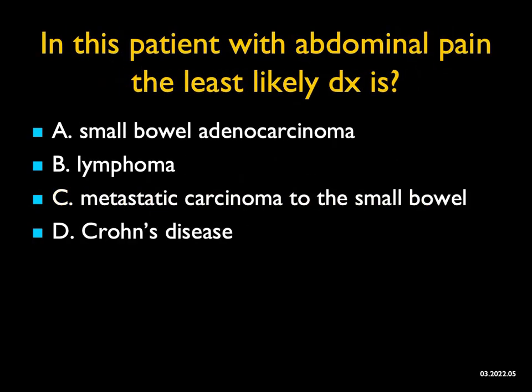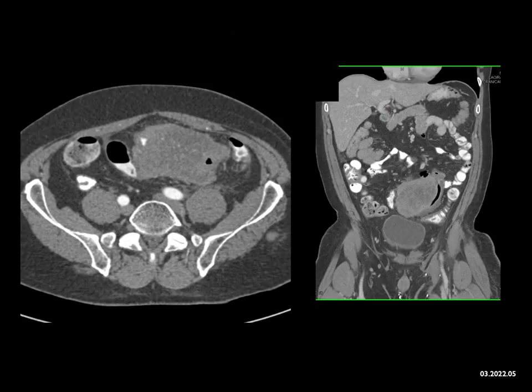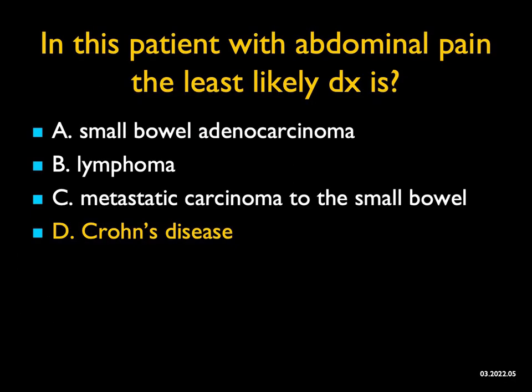In this patient with abdominal pain, the least likely diagnosis — I see an infiltrating tumor involving the small bowel. It may be in part exophytic, but it's an impressive lesion. Without even looking at the answers I'm thinking small bowel adenocarcinoma. It's bulky, so I'm thinking about lymphoma. I could also think about metastasis — this patient previously had a Merkel cell tumor, and this was metastatic Merkel cell in the small bowel. Most common metastases would be things like melanoma, perhaps renal cell carcinoma. This does not look like Crohn's disease. Crohn's disease is wall thickening, submucosal enhancement, prominent vasa recta. So the least likely diagnosis in this case would be Crohn's disease.